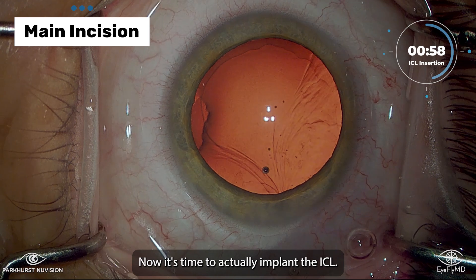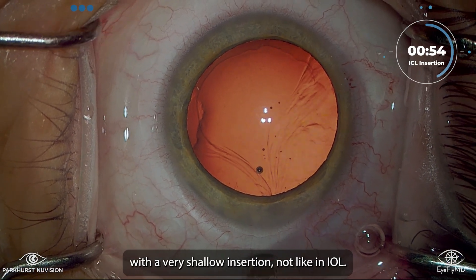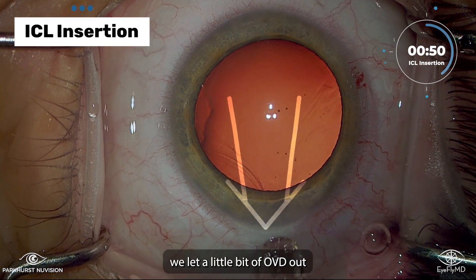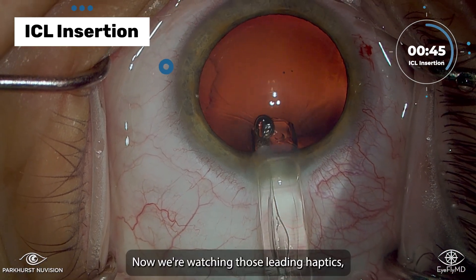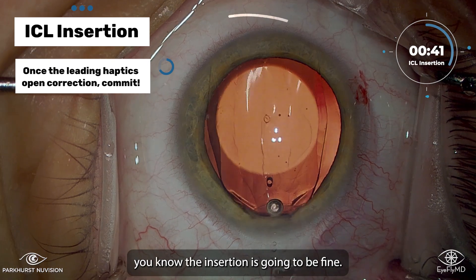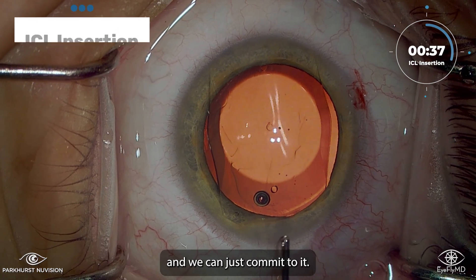Now it's time to actually implant the ICL, and we're going to do that with a very shallow insertion — not like an IOL. We're not aiming for the bag; we're aiming for the angle. But before that, we let a little bit of OVD out, just so there's less behind the actual lens. Now we're watching those leading haptics, and once they unfold in the right orientation, you know the insertion is going to be fine — it's going to open correctly and we can just commit to it.